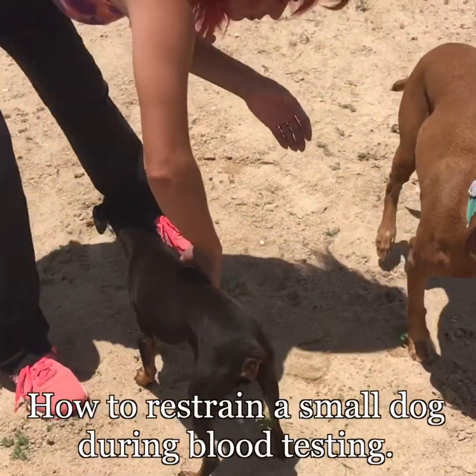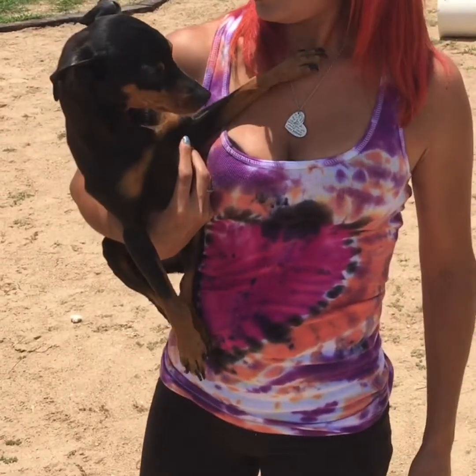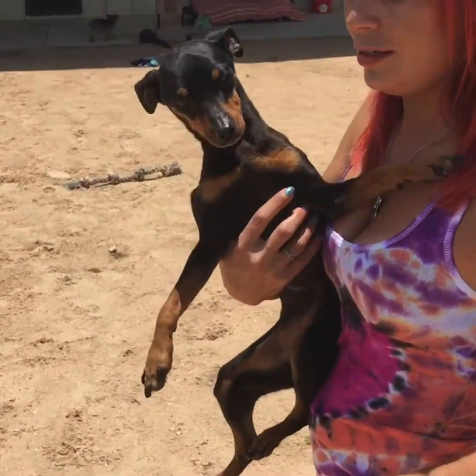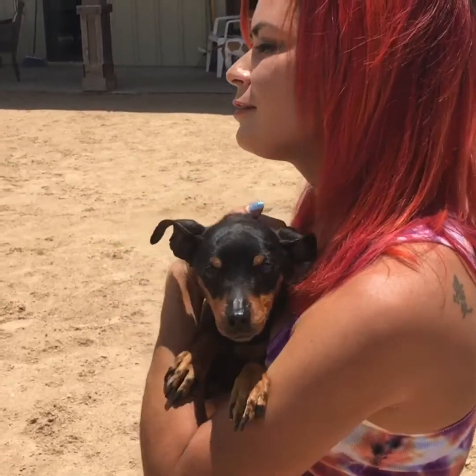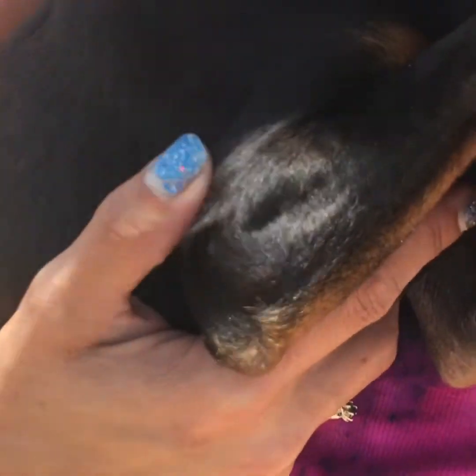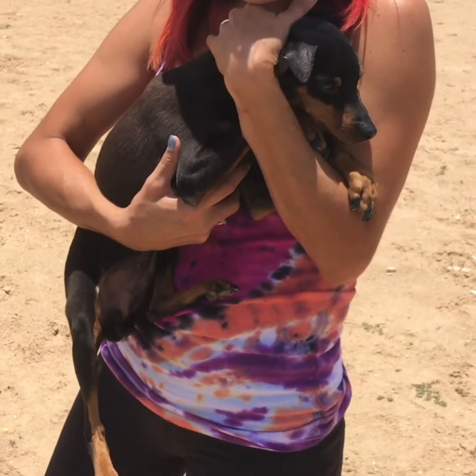Amber is going to show us how to restrain a smaller dog that has some sass and will bite if it's not her idea. When taking blood glucose or ketones on a smaller dog, what you do is pretend you're going to hug her — just hug her, you don't have to squeeze too hard — and that leaves you access to the elbow. Even without large calluses, there's a little callic area you can poke right in the middle of, or you can also use the back feet pads.